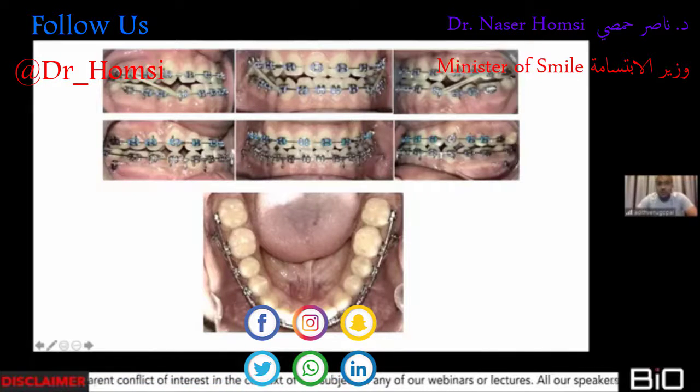And I usually use 2 hooks for distalization because, in my opinion, and this is again anecdotal and not evidence-based, I find some kind of vertical bowing when I use the power chain directly from the buccal shelf over here to this anterior hook. Although the wire is stiff, I still notice that.